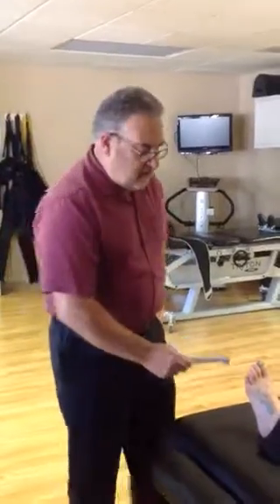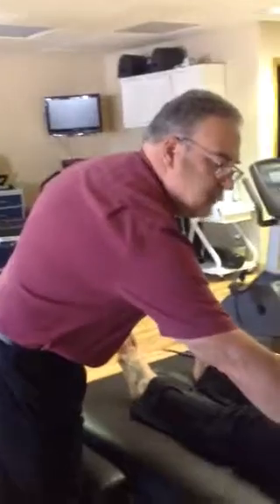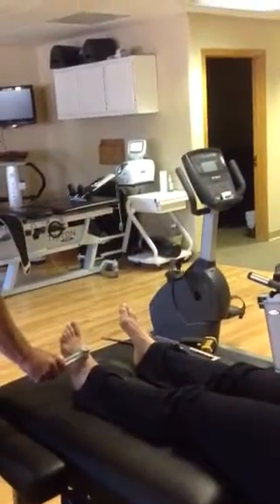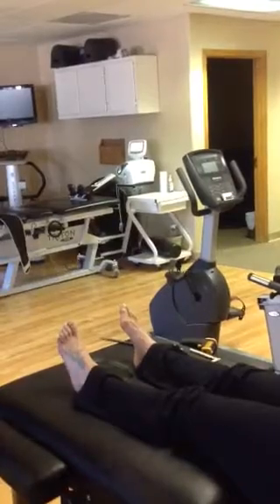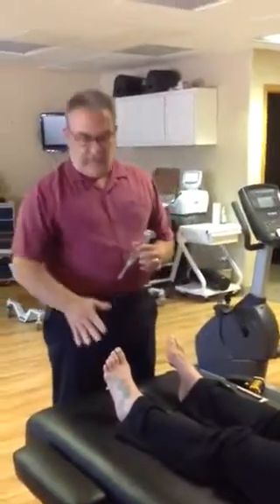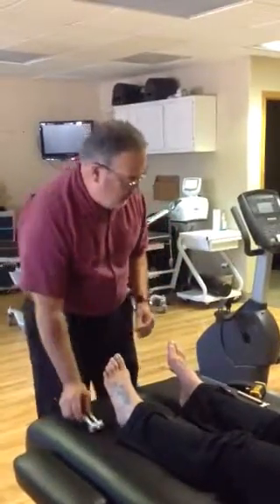This way I'm checking out the cool fibers. If I touch the foot, I'll say something like, let's give this a number 10 for the cool sensation. And what would this be right here? For me it's a 10. So that's perfect. Some people are a 3, which means they're not getting as much of the small nerve fibers that test temperature.